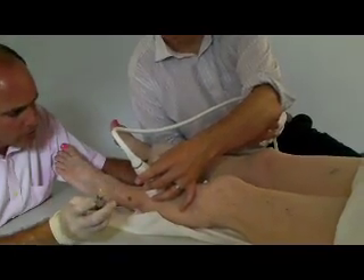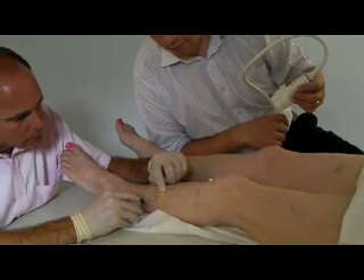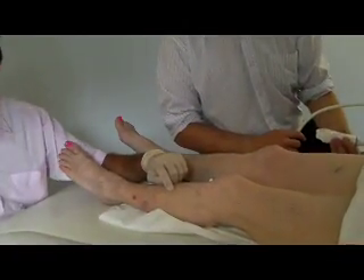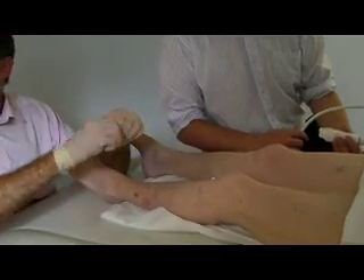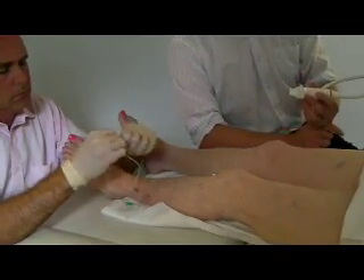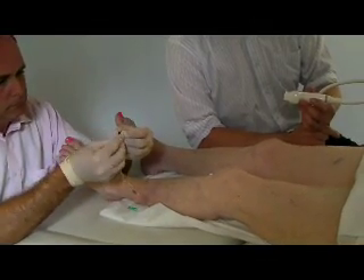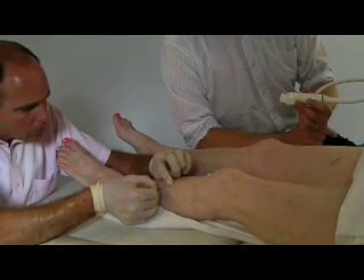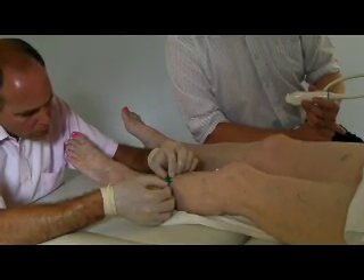Firstly the ultrasound is used to identify where the vein is, then some local anaesthetic is placed into the skin in very much the same way as it was placed to put the larger needle into the vein in the thigh. Sometimes it's possible for the doctor just to pass a small needle into the vein under direct vision; sometimes they need to use the ultrasound. In this case a 23 gauge butterfly needle is being used and that's going to be passed into the patient's vein over the front of their shin. The doctor knows that the needle is inside the vein when they see a flash of blood passing back down the tubing, and you can see that in this image.